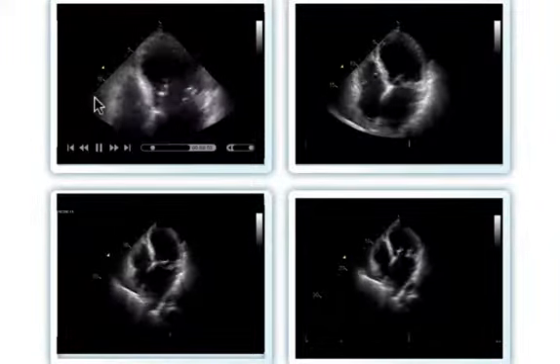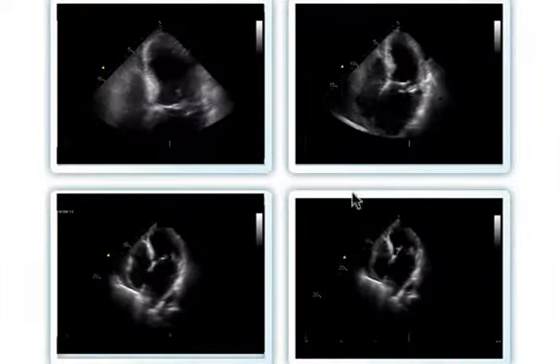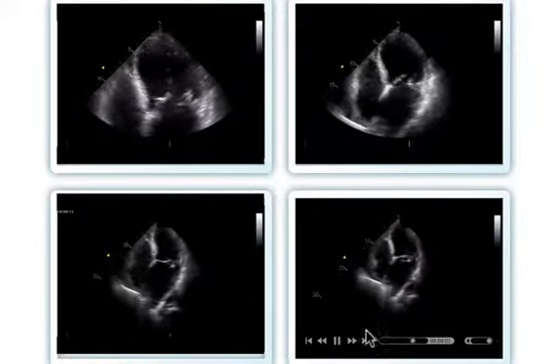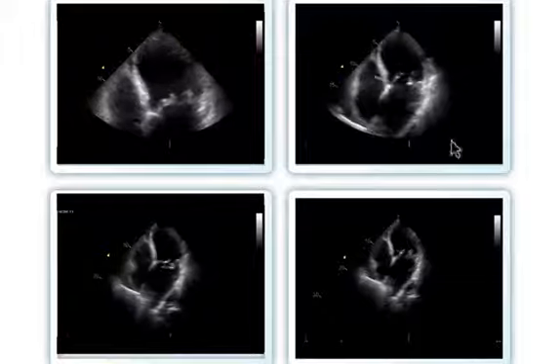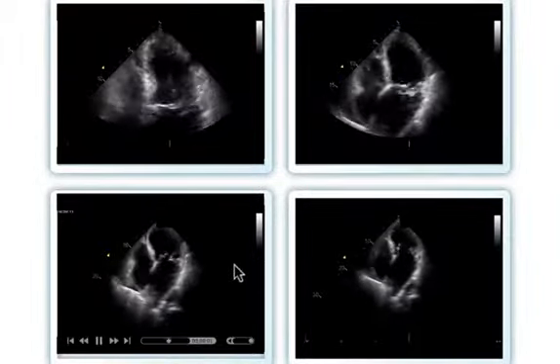You can see that in this case we do not have the entire heart on the screen, while we do have the entire heart down here, but we also have a lot of information which you do not need. So in reality, you should use some kind of intermediate setting, for example, a setting like this, and maybe like this.